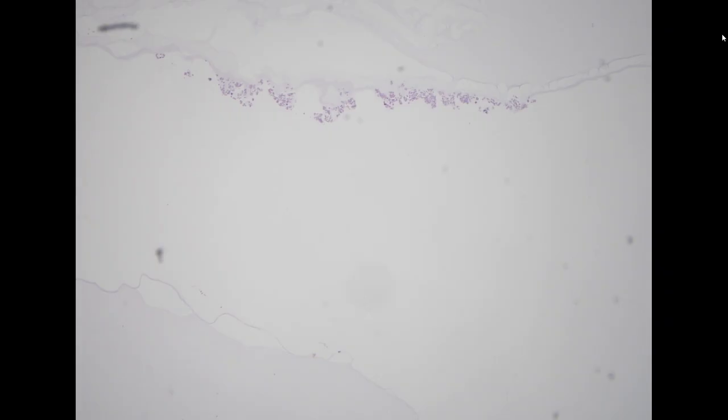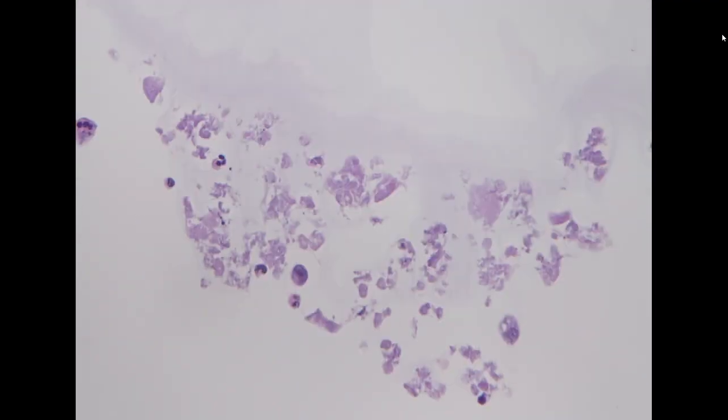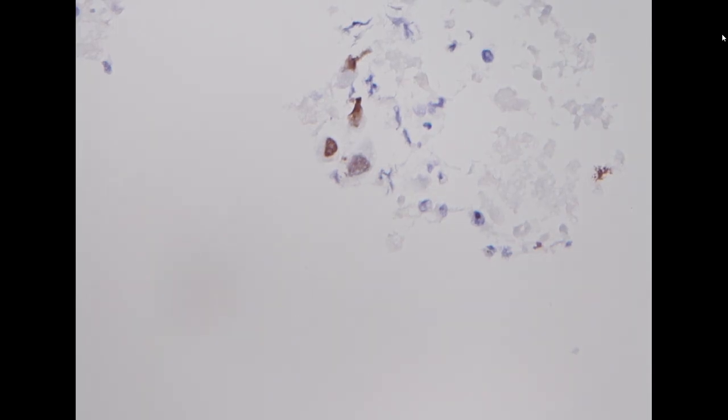In this situation, we highly rely on the cell block preparation for additional confirmation of the cell origin. But here we see the majority of the cellular component is actually necrotic debris and necrotic ghost cells, which is very difficult for us to confirm the origin. Dr. Gao performed TTF1, PAX8, and P40. There are some positive cells for P40, which suggests that the cells may have some squamous differentiation. In the thyroid, primary squamous cell carcinoma is now considered a variant of anaplastic thyroid carcinoma, and it can also arise from papillary thyroid carcinoma. So this is highly suggestive of high-grade malignancy and likely anaplastic thyroid carcinoma.